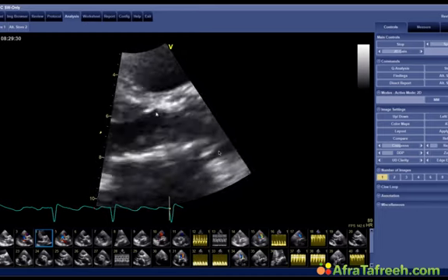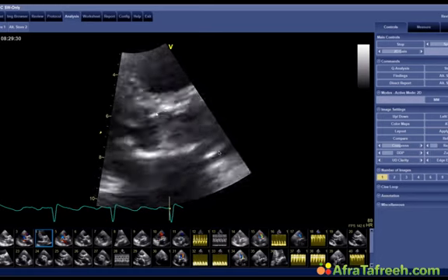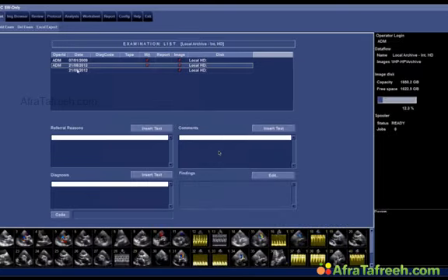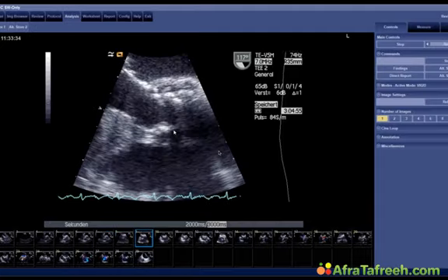But now, of course, we can go on and say diagnosis is clear, she has endocarditis, we don't need to go further. But there are some issues which need further clarification. And I will now show you the TE study and show you exactly why a TE does provide so much additional information. I'll go right to the aortic valve.